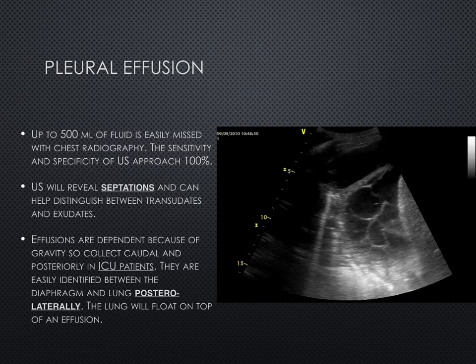The value of lung ultrasound is not only in the identification of pleural effusions within this space and ability to quantify that amount of fluid within the pleural space, but also in the ability to identify the type of fluid that you're seeing, whether that's a transudate or an exudate, and identification also of any septations or densities, so something like a blood or clot within that fluid that you might want to be aware of if you're thinking of draining that.